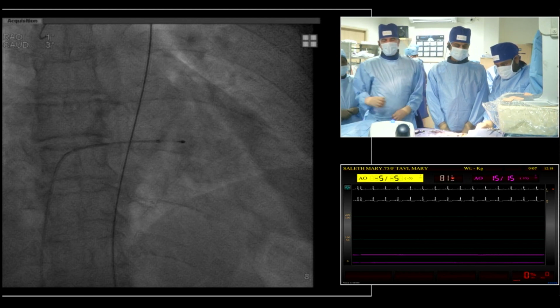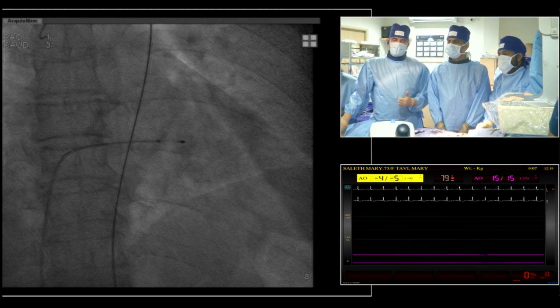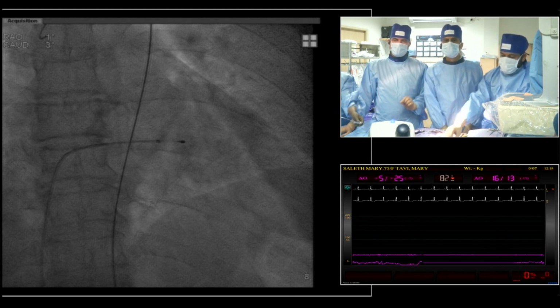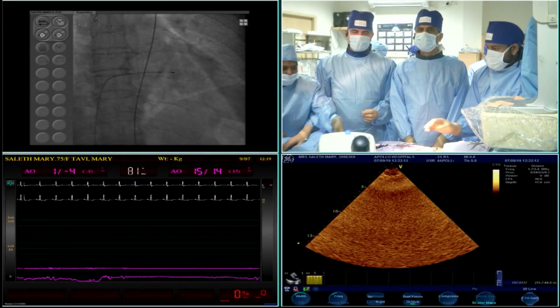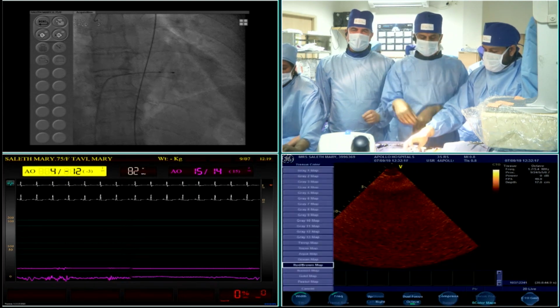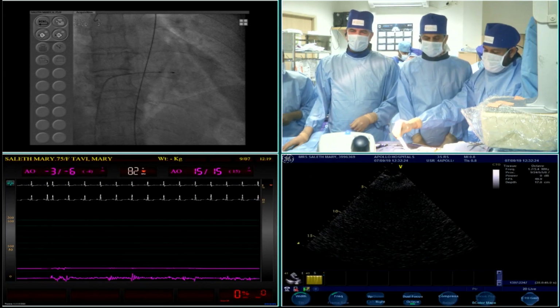Okay. So Thierry, Kentaro, if I can just add there, we're ready to move forward with the procedure. We hear the points that you're making about making sure that you hit the front wall of the artery with a central puncture. That's very, very important. And as Kentaro says, it's important also that you have some flexibility with your approach. So ultrasound is very good, but it's not possible in every patient. So to have the contralateral access with fluoroscopic approach is also very helpful, particularly for obese patients.